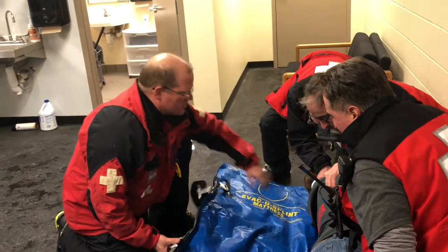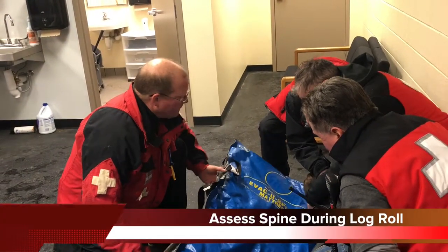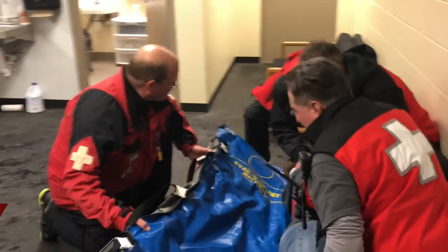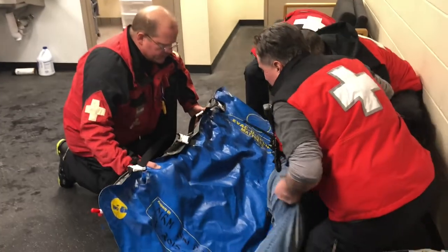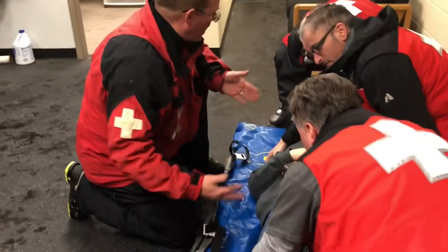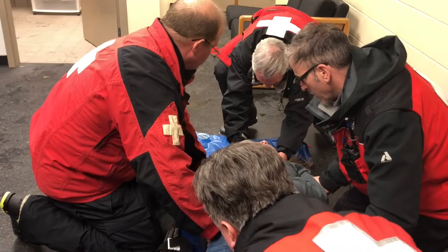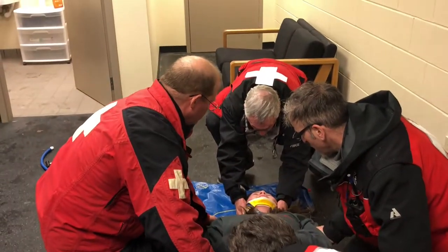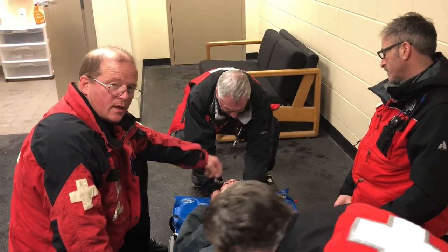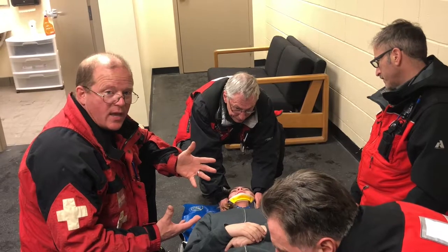If you haven't done so already, this is the time to assess your patient's spine for any injuries. Then on the head count, we log roll the person back — one, two, three. At this point he's not centered, so we slide him down and over on the head's count — one, two, three. At the top or head of the splint, there is a yellow circle. That's the marker where the patient's head should be placed.